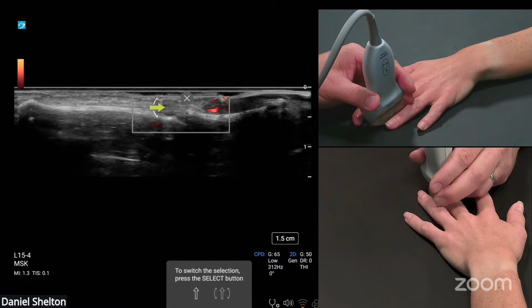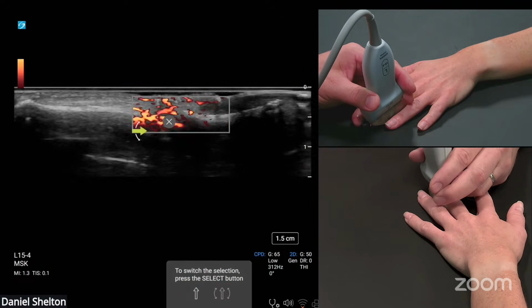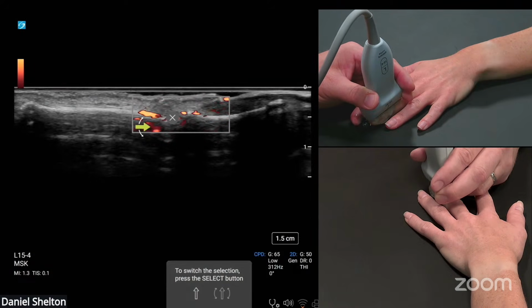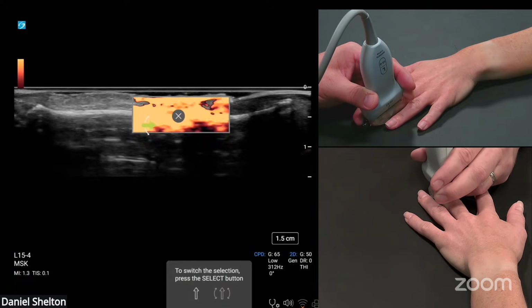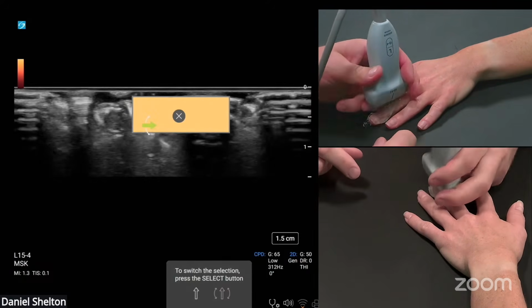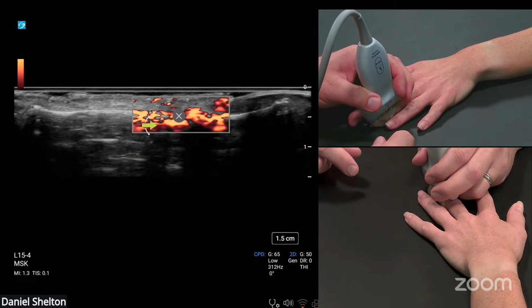And what's happening here is the Doppler effect is catching these echoes, and we're catching reverberation under the bone. And when we see that reverberation under the bone with something that's moving with reverberation, it also assigns it a Doppler shift, but it will be in the exact location opposite to the bone. So we're seeing a perfect reflection upside down of that vessel underneath the cortex. So we're not seeing flow under the cortex. That's not real flow. That's mirror image artifact. It's a pretty cool property of a Doppler exam to be aware of, or a color exam.